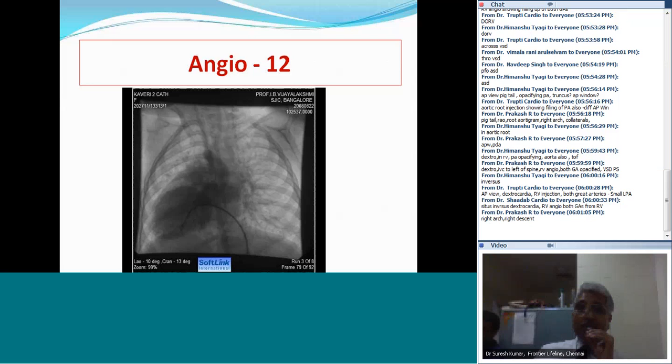venous structure. So the pulmonary artery injection, actually the catheter is slipping into something here and that is the anastomotic communication with the LA. So if you called it pulmonary AV fistula, it's fine with me, or a pulmonary AV malformation, it's fine with me. But if you were able to see this angio in detail, you would notice that your opacification is directly from the LPA through a communication into the left atrium. It's not a PAPVC because whatever opacification you are seeing is not in the levophase. It is directly after the arterial injection.